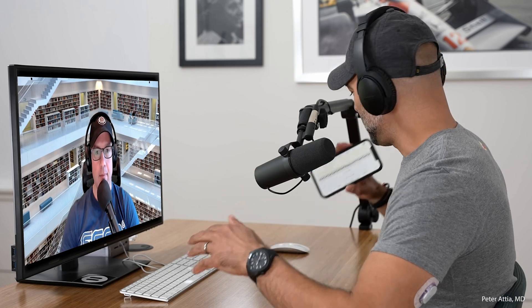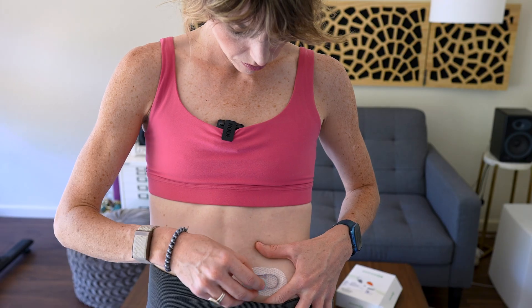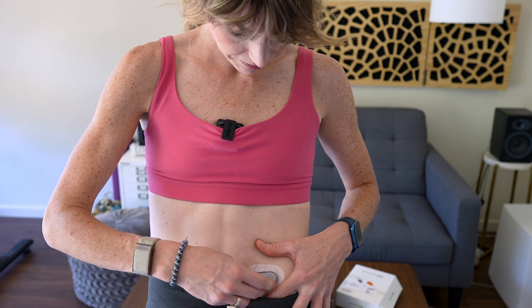You know, the one that Peter Attia and that younger Jonas brother — I forget his name, Steve maybe — has been wearing and raving about, well, long before CGMs became a trendy arm accessory. And I actually recently had the chance to test it out to see for myself what this G6 is really all about.